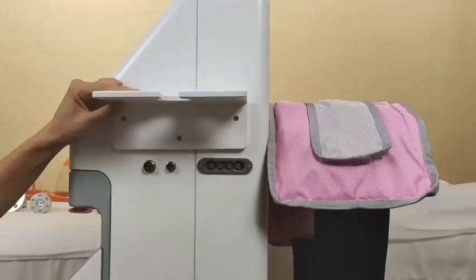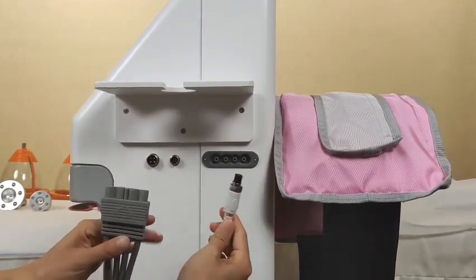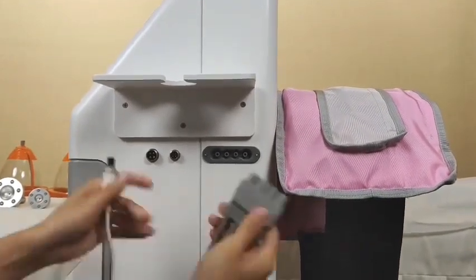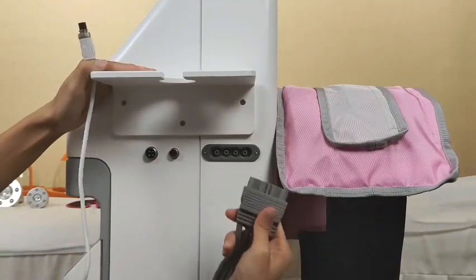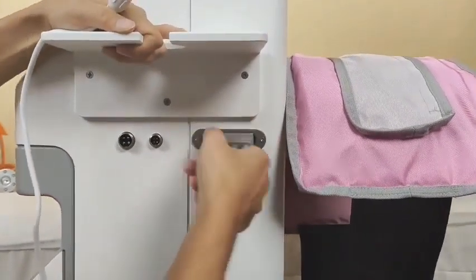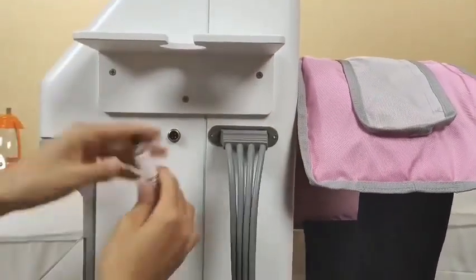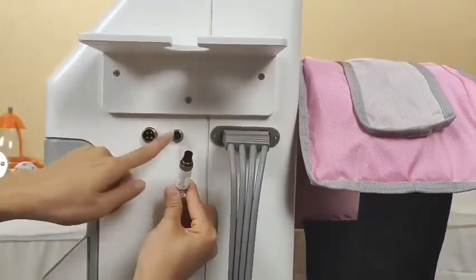Now we install this machine. This is the infrared pressure therapy. We should insert this tube into this hole, then press, and this part we should match the hole inside.